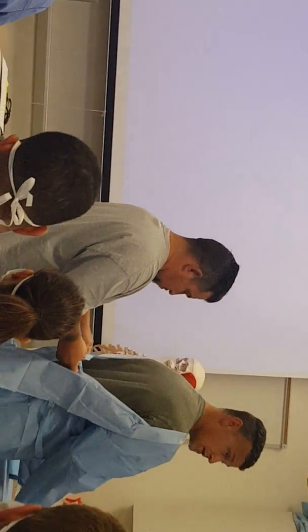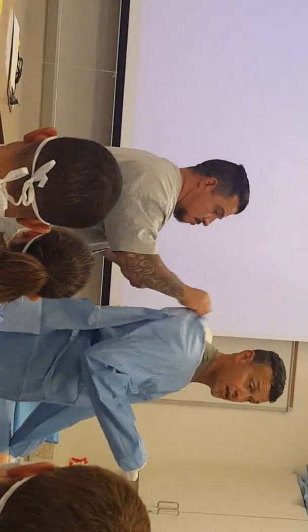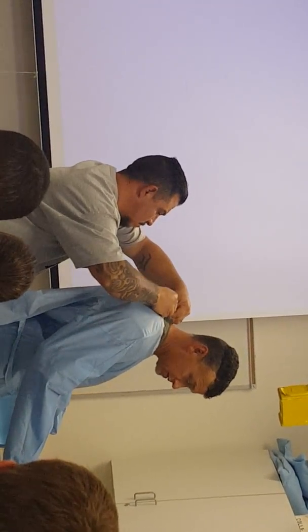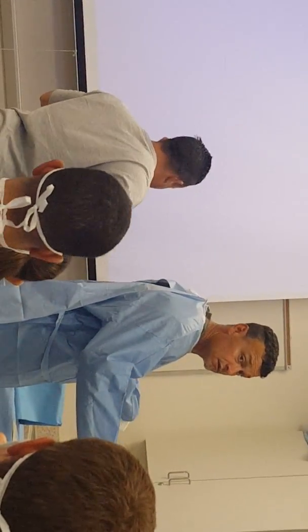This is where I have my question. The guy didn't see my gloves on. That was in the video. The guy behind, he doesn't have to have gloves on to do that? He does not. Sometimes it depends on the size of the gown. So it's Velcro up top. He ties on the inside there. Got it?